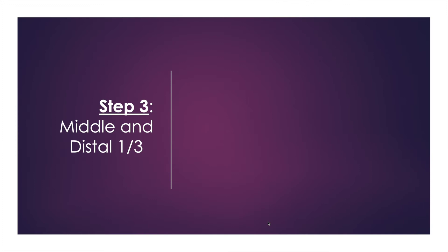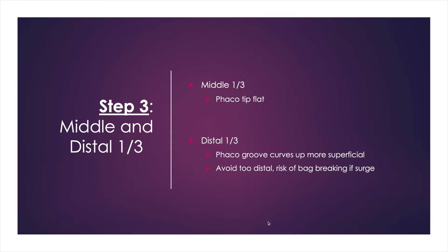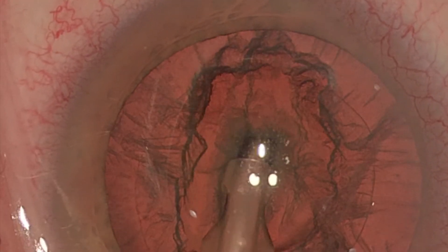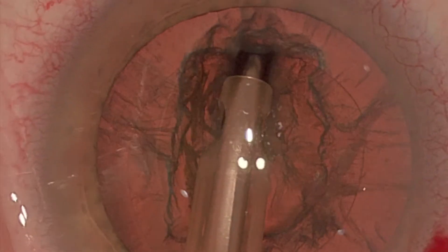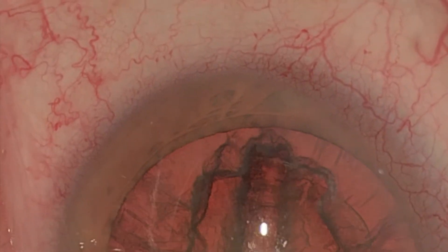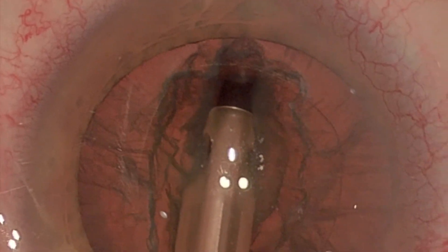The third step is to then approach the middle and distal third of the lens: staying flat in the middle section and then curving upward and superficial in the distal third. This is the same groove being created, but now the camera is focused on the middle and distal third. You can see the groove is being created with the phaco tip mostly flat in a safe position.